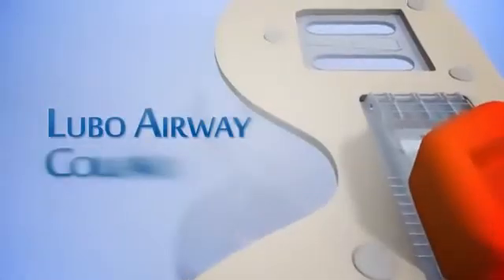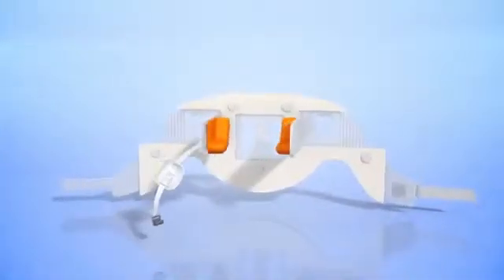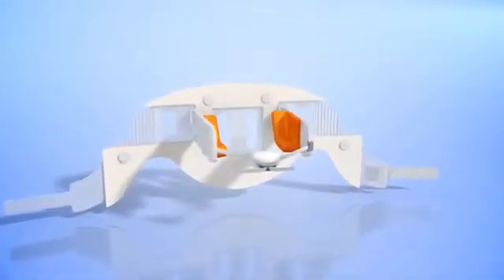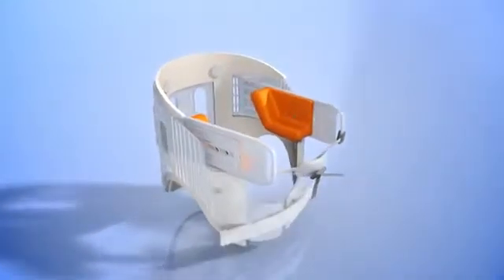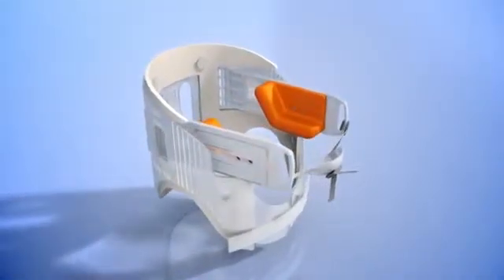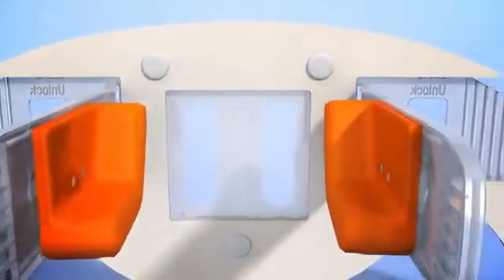The Lubbo Airway Collar is the only non-invasive device that can open an airway by imitating the jaw thrust maneuver, with or without the need for cervical spine immobilization. This device is a one-piece, adjustable to size, single-use, radiolucent, and easy to operate. For use by EMS professionals as well as any basic life support (BLS) trainee.